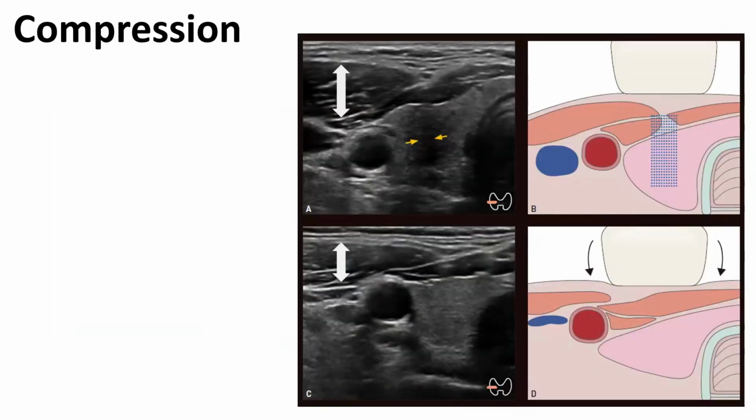If you don't press it properly, fake lesions can occur. The thicknesses of the SCM are different in the image above and below, and the image above shows that it was not properly compressed. You can see the hypoechoic lesion in the right thyroid gland. After pressed well, the lesion disappeared.